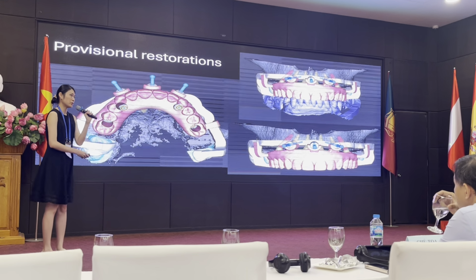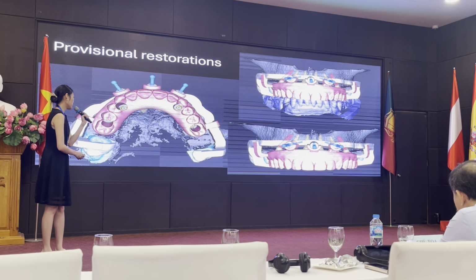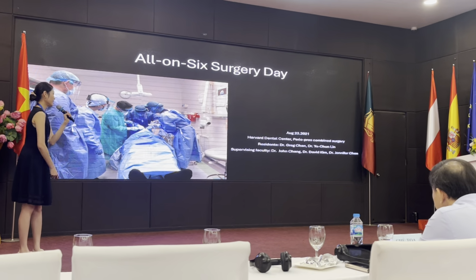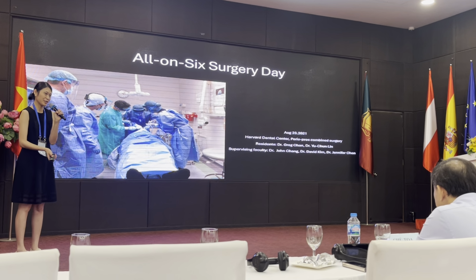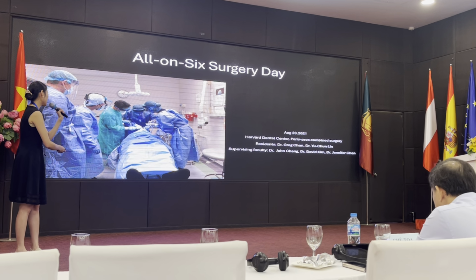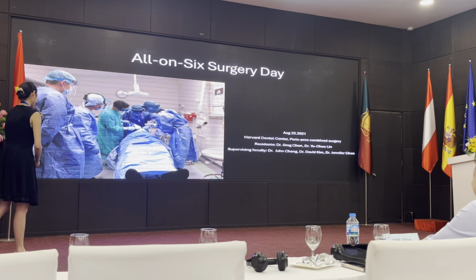And then because we want to do immediate extraction and immediate loading, we also designed a provisional restoration. And that was a long day. I worked with the residents, and we went through it like a surgical team together with the implant company, and we decided to do a surgery from 7 o'clock in the morning until 7 o'clock at night. So that's a long surgery day for the patient.